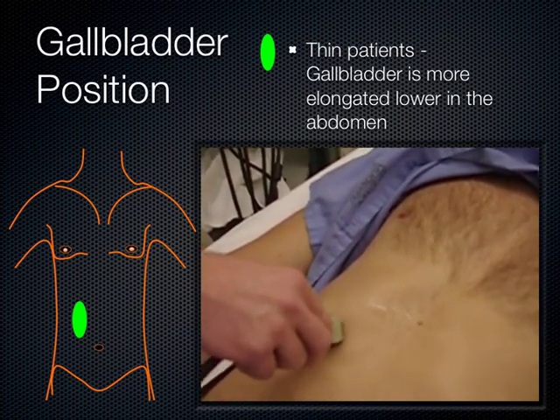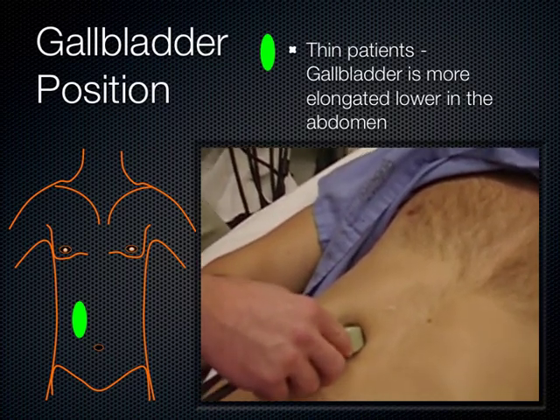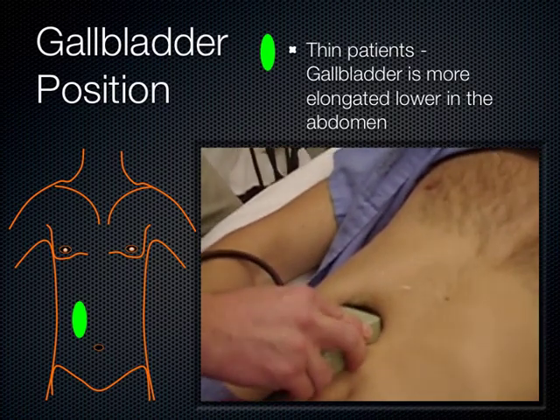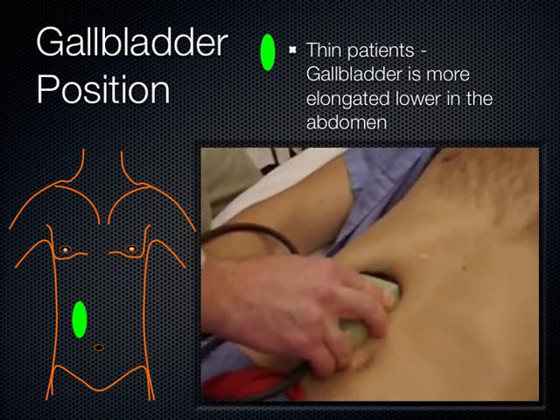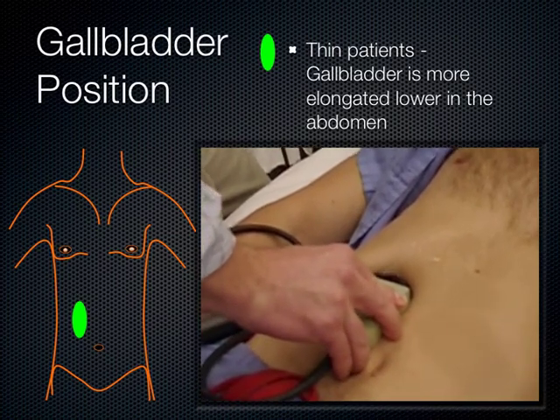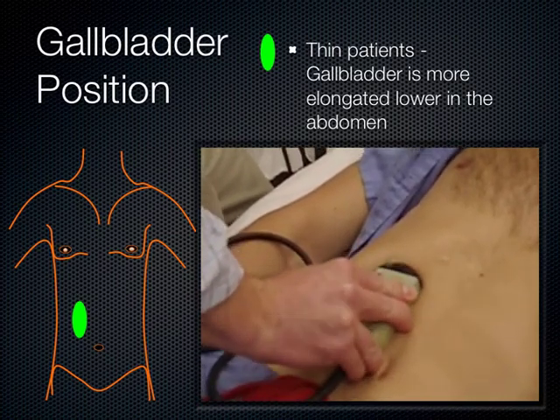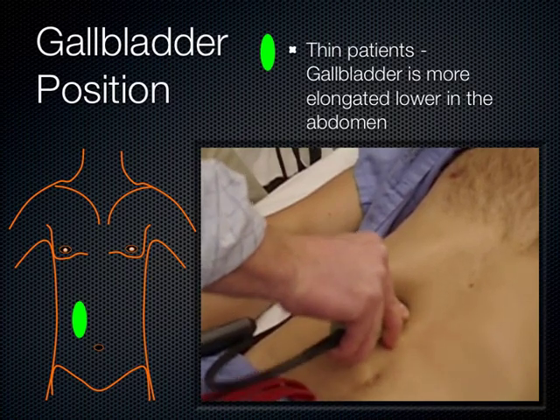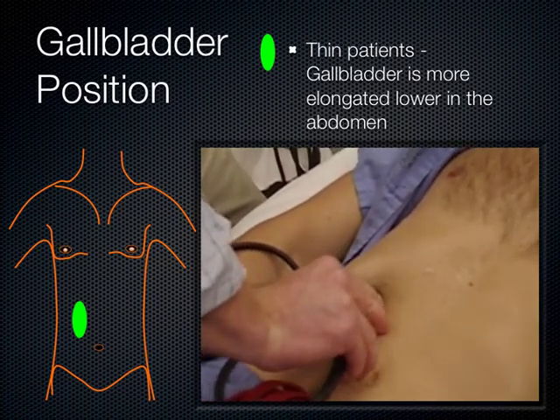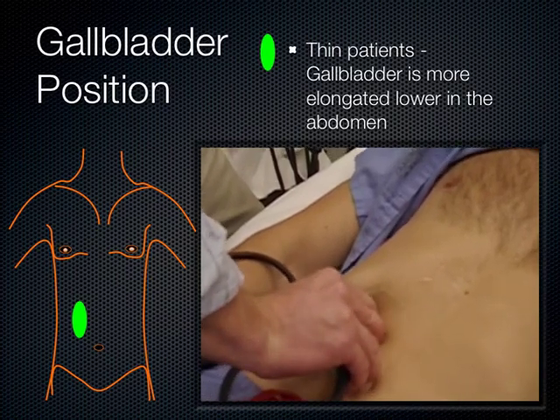In those patients, if you can't find it with the subcostal sweep or the X-7 approach, it's often helpful to take the indicator and really flatten it out against the abdomen. The indicator is pointed towards the patient's right. The probe itself is flattened out as much as you can. You kind of fan through the gallbladder anterior to posterior as you work your way laterally. And oftentimes you'll find the gallbladder up in this area here.